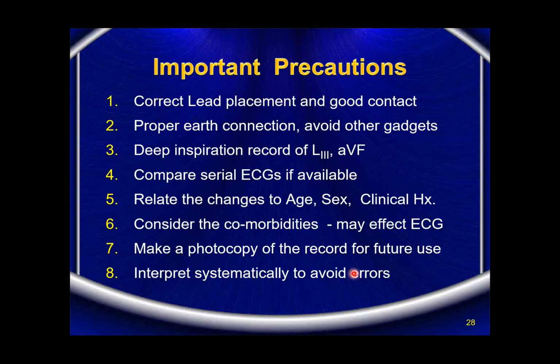The proper earth connection is essential, because we don't want electrical disturbances to be recorded, and we don't want by chance a small current in the machine to give a shock to the patient. And avoid other gadgets plugged to the same switchboard. If you are dedicatedly using ECG from a switchboard, no other instrument should be connected to that.